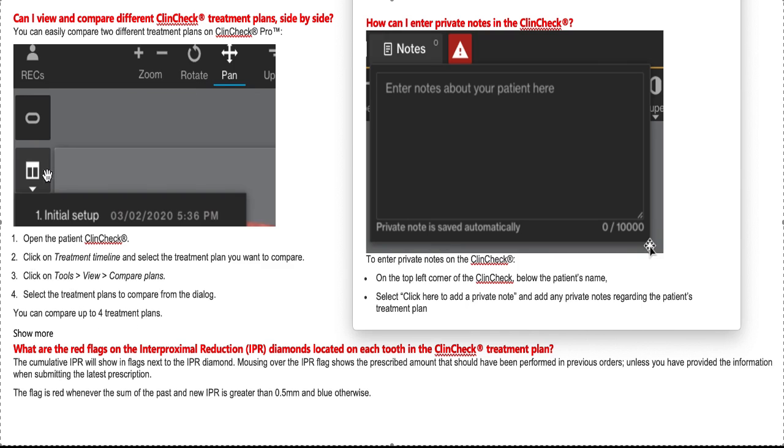A good thing about this new ClinCheck is you can hover your mouse over the different buttons and it tells you what they are. You can also reorganize the whole top panel to configure it and make it easier to understand. Pretty cool.